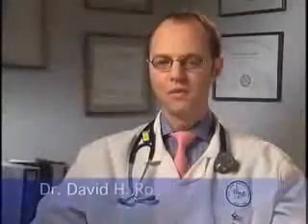Hi, I'm Dr. David Robbins, the Director of Endoscopic Ultrasound at the Beth Israel Medical Center in New York City. If you've had long-standing heartburn, your doctor may order a test called an endoscopy to evaluate for signs and symptoms of something called gastroesophageal reflux disease.